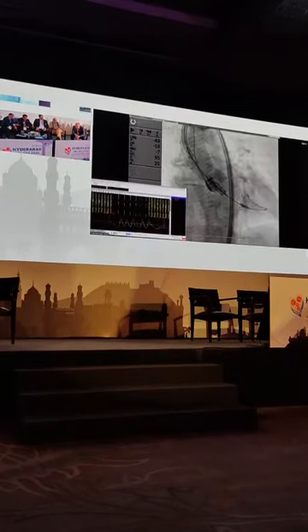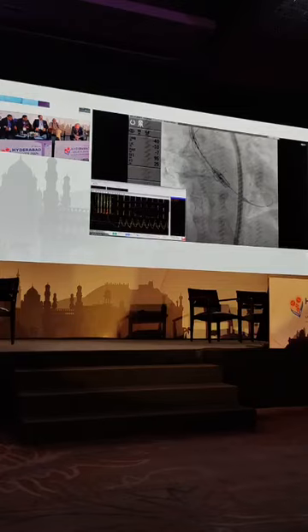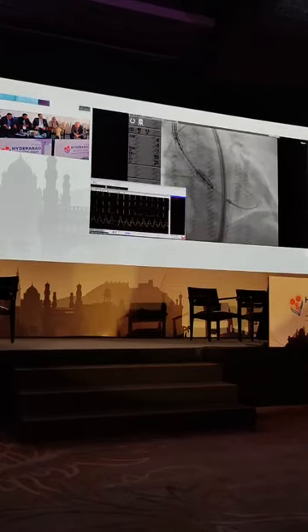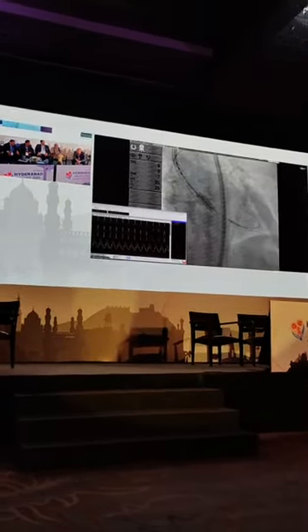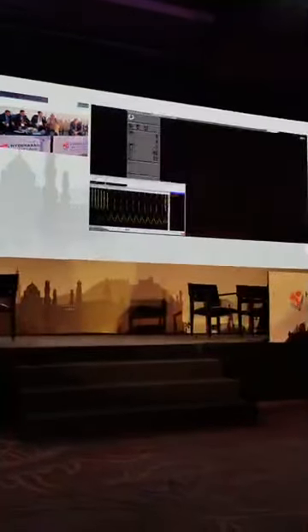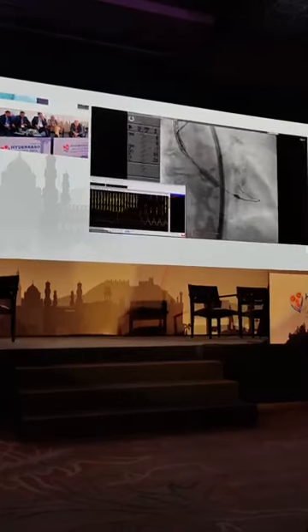So it could be a little deeper. A little deeper, yes. So I advance it a little. Okay, we do it for rapid pacing again. Rapid pacing. Injection. Stop pacing. I think it's good.